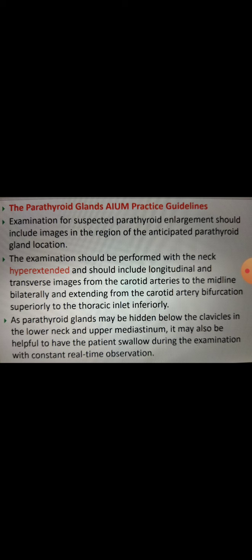The maneuvering of the probe should be from the carotid arteries to the midline, extending from the carotid artery bifurcation superiorly to the thoracic inlet inferiorly. So that will be your approach when you are scanning for the parathyroid glands.